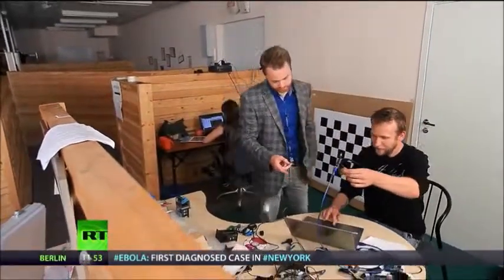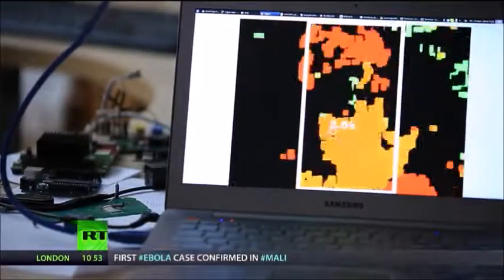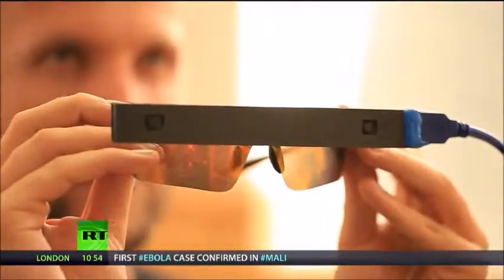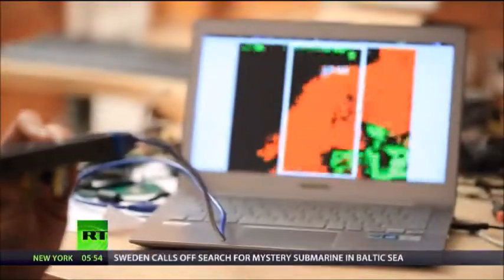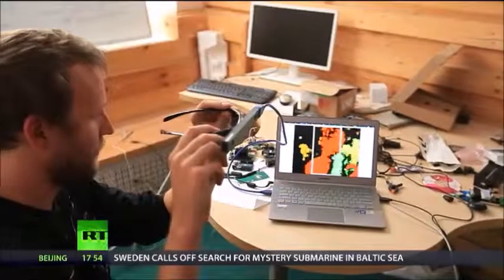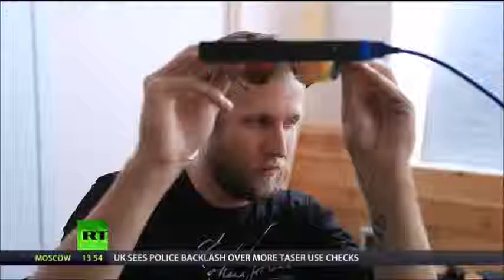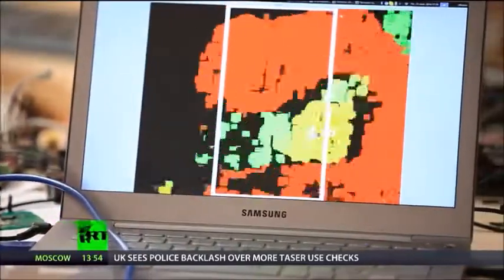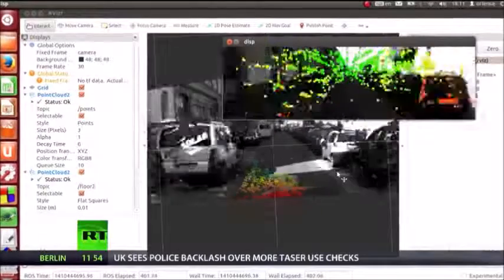The two cameras are spaced roughly the same as human eyes and sense depth in pretty much the same way. By comparing information about the same scene from two different points, 3D information can be extracted by analysing the relative position of the objects, so the bigger the difference, the closer the object. Using fairly low-resolution cameras provides enough information to analyse the environment within an accuracy of a couple of centimetres, while lowering the load on the processor and increasing battery life, providing a cheaper and more lightweight alternative to the laser-powered LiDAR.